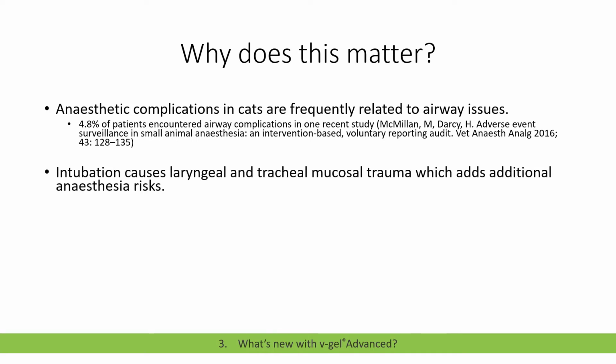We know that intubation causes laryngeal and tracheal mucosal trauma. That's been very thoroughly proved, and all of us that anaesthetise cats on a regular basis will hear upper airway stridor related to that trauma. It's not that it's fatal in every case, but it certainly does increase the risk involved with feline anaesthesia.